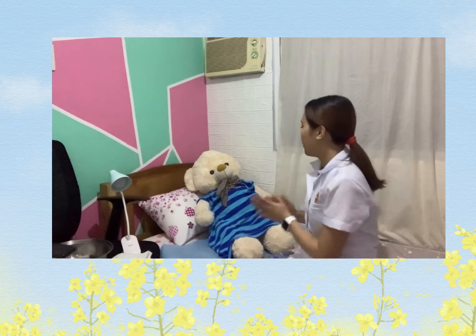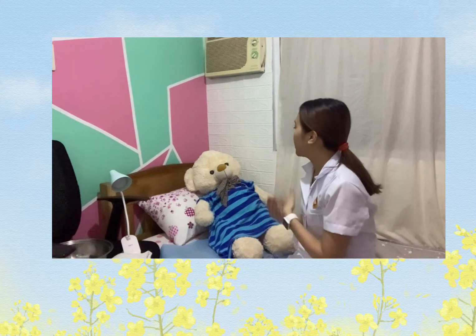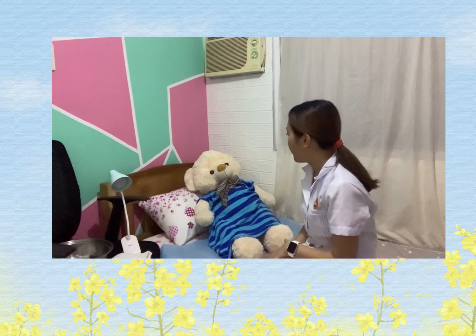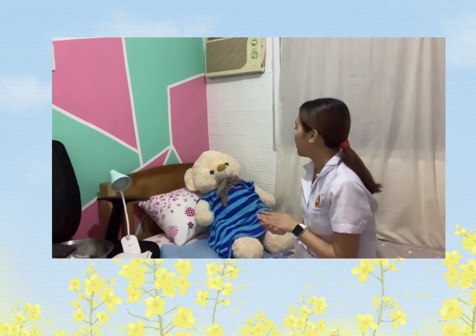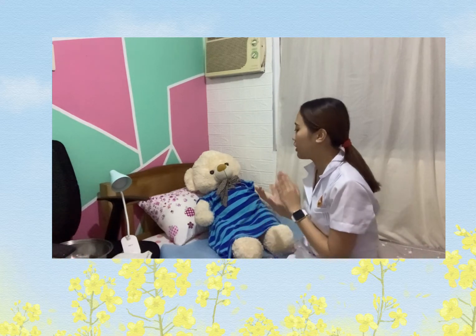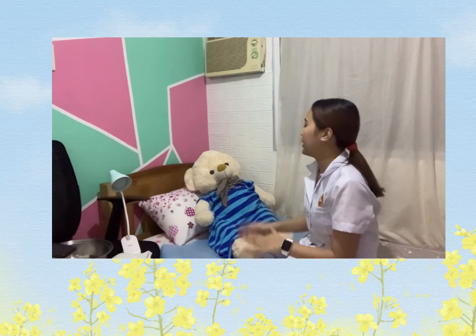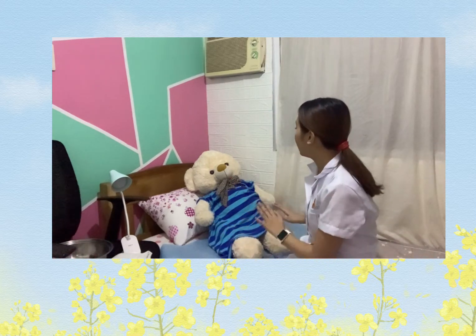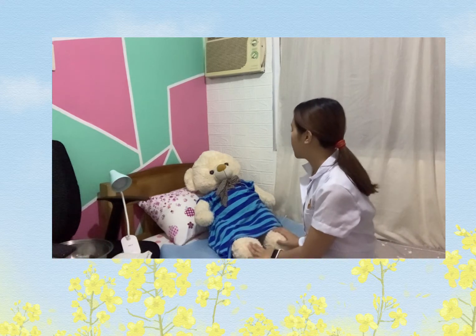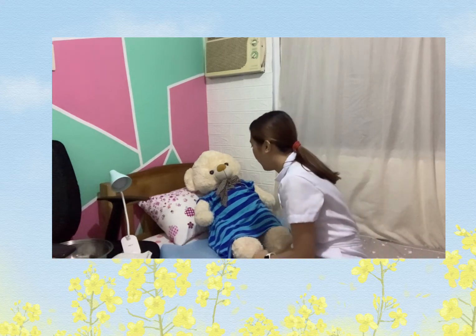Okay. Perilite exposure will be performed to provide comfort on your perineal area. Also, ma'am, it will increase the blood circulation that may hasten the wound healing recovery. Ma'am, you can cooperate later by not touching the lamp and by not changing your position so that the therapy will be beneficial. Is that okay with you, ma'am?